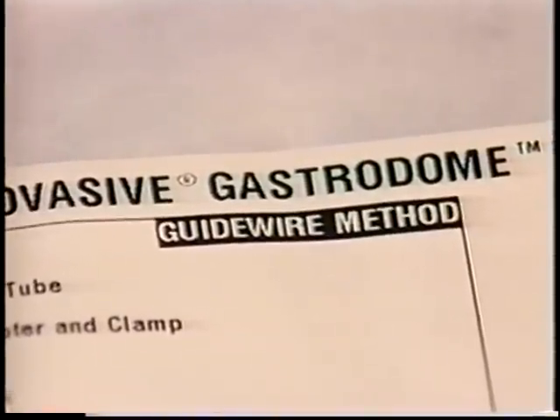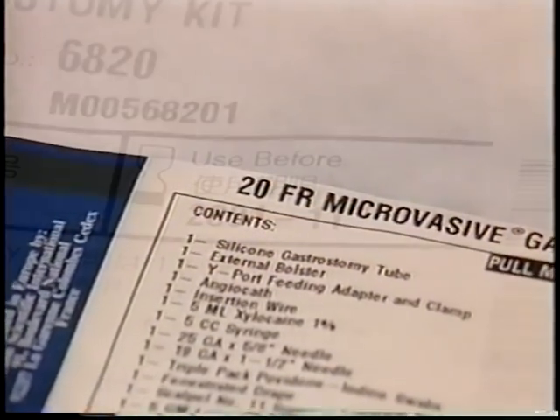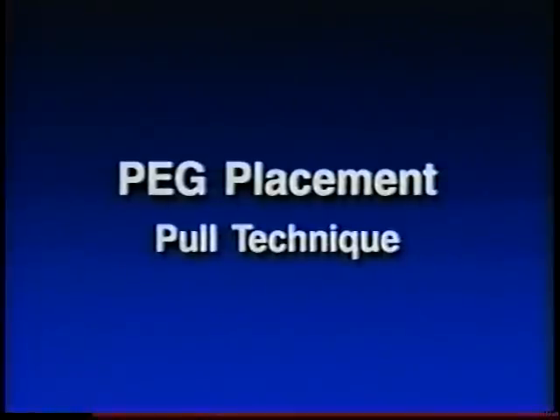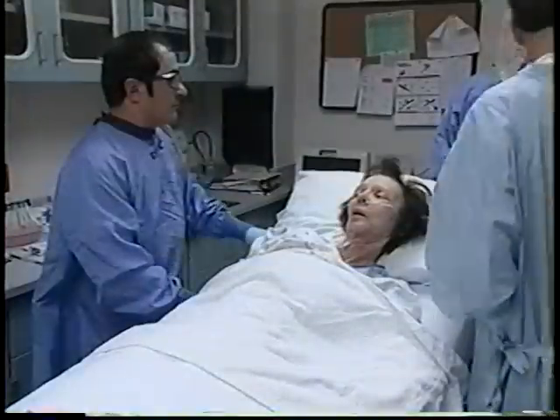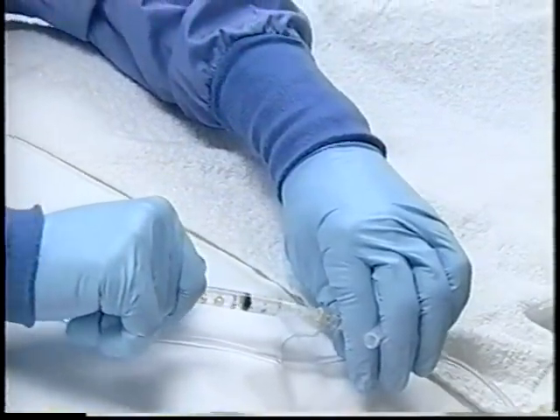Kits are available for each and are labeled with that information, along with the French size of the tube and a use before date. Dr. Delegui will demonstrate the pull technique for PEG. To start the procedure, the patient is positioned supine with the head elevated and appropriate conscious sedation is established.